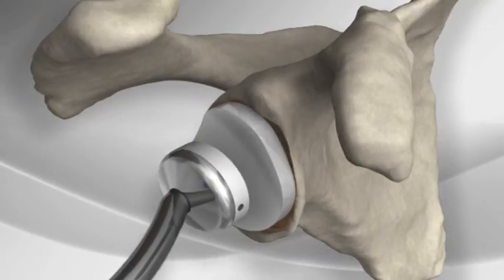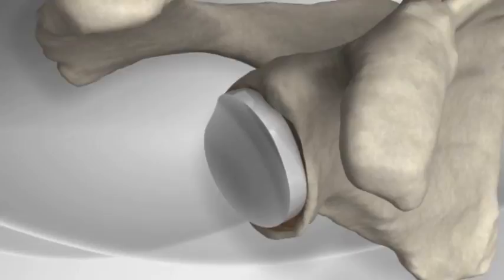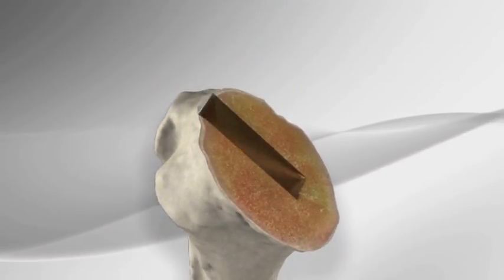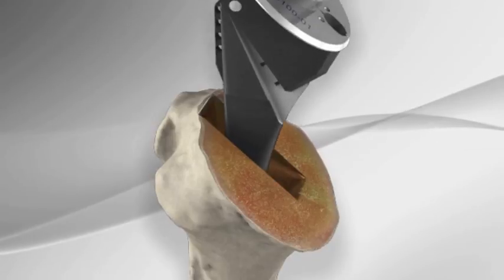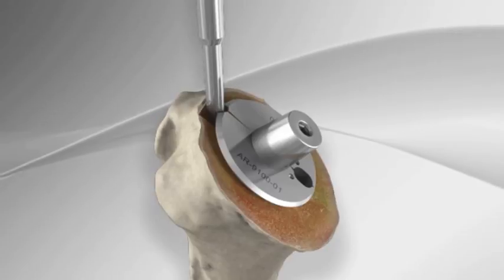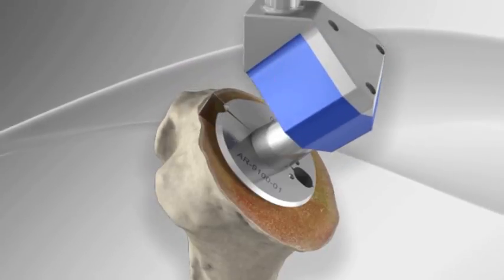Once the cement has dried, attention is turned back to the humerus and the trial prosthesis is removed. The final prosthesis is impacted into the humeral shaft. It can also be cemented if necessary.